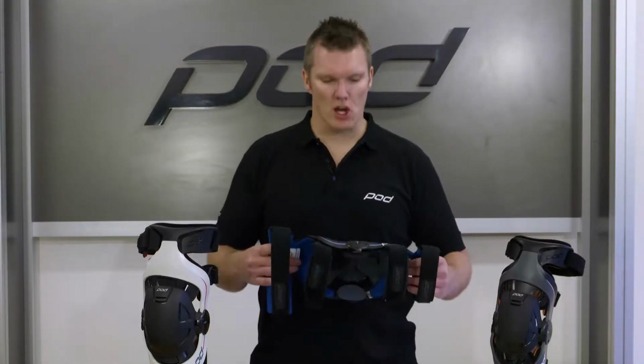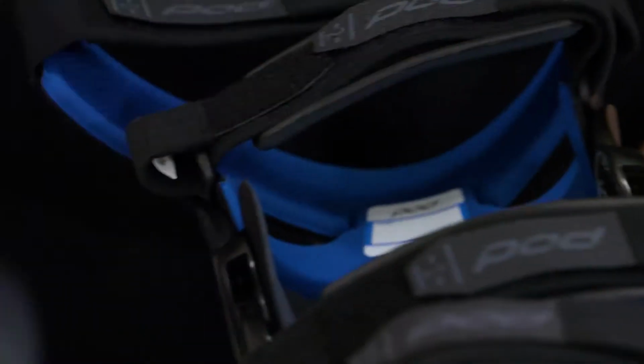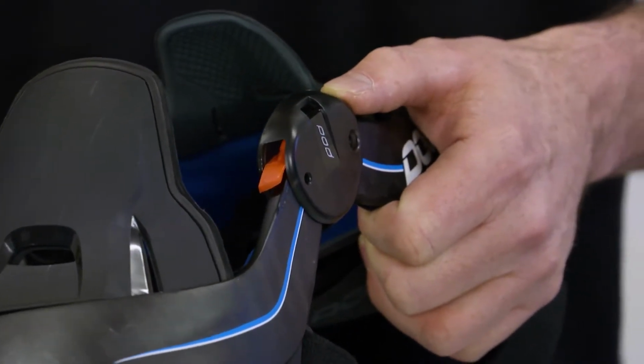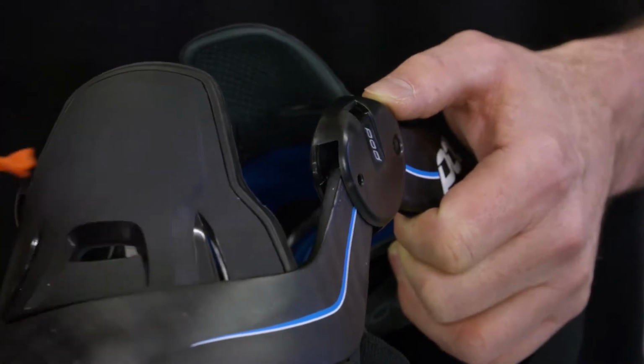So now we'll actually show you how to replace the hinge housing and the ligament on your K-Series brace. So firstly, remove the hinge pads, whether you're using the thick or these grey thinner pads. Remove the hinge pads. If you're using the hinge stops within your hinge housing, you will need to remove those red hinge stops before you can replace the ligament and the hinge housing.